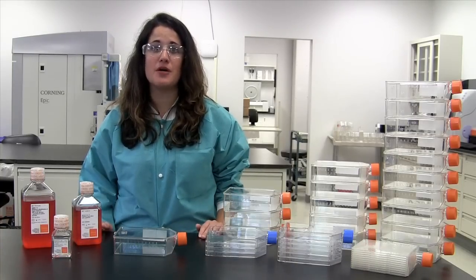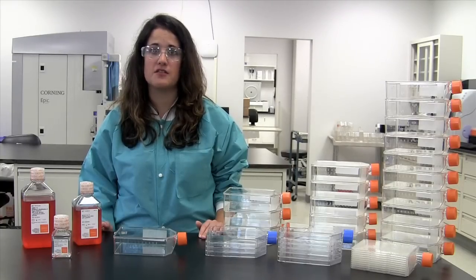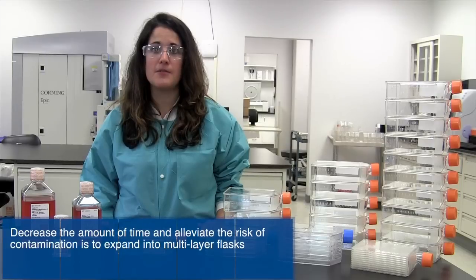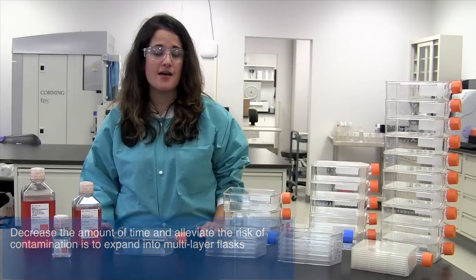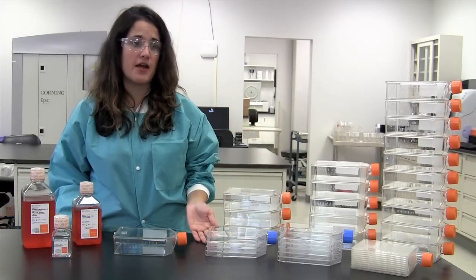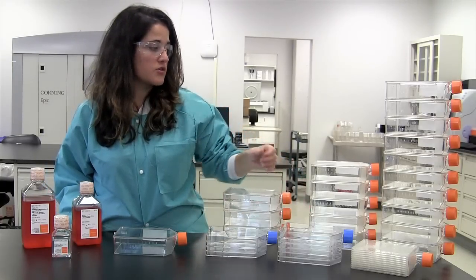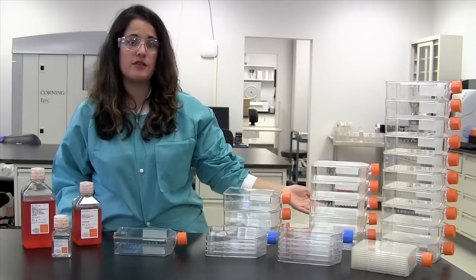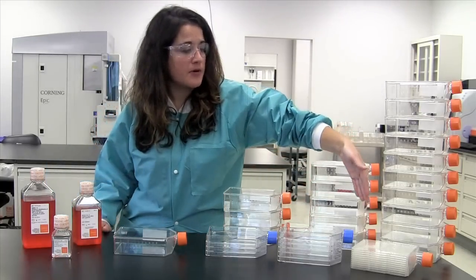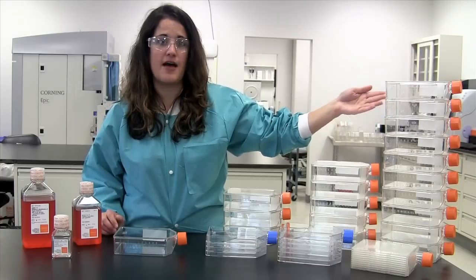When expanding cells into multiple vessels, the amount of time and the risk of contamination increases. One way to decrease the time and alleviate the risk of contamination is to expand into multi-layer flasks. Here I have a 3-layer flask, which has a similar growth area to 3 T175 flasks; a 5-layer flask, equivalent to 5 T175 flasks; and a hyperflask, which has a similar growth area to 10 T175 flasks.